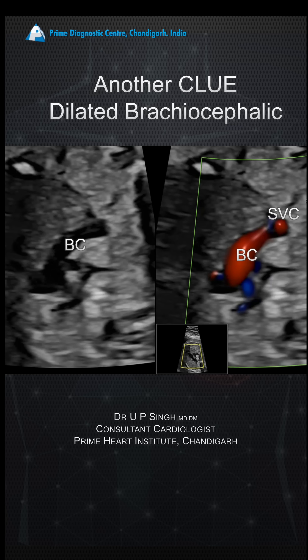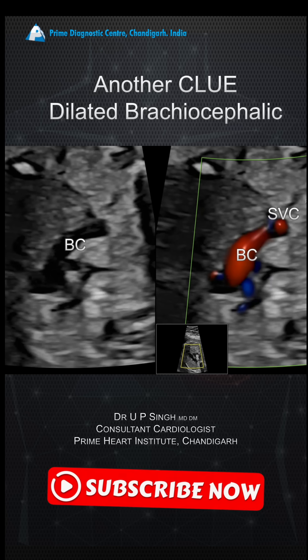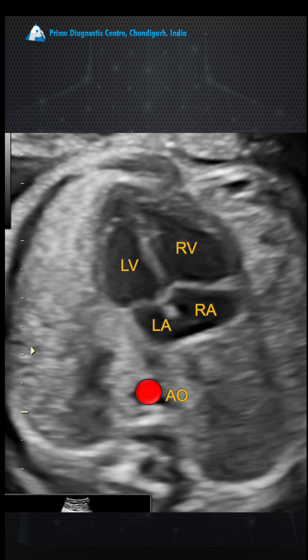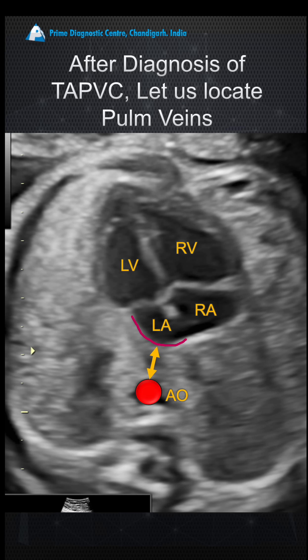So if you have these two findings, it's a great clue. In the four-chamber view, you see the distance between the aorta and the left atrial posterior wall is increased — so much so that you could place another aorta there. And you see a smooth-walled left atrium with no pulmonary vein entering it. This is the diagnosis of Total Anomalous Pulmonary Venous Connection (TAPVC). But it's not going to end here — we need to find out where the pulmonary veins are going.